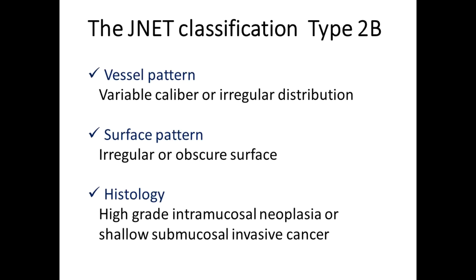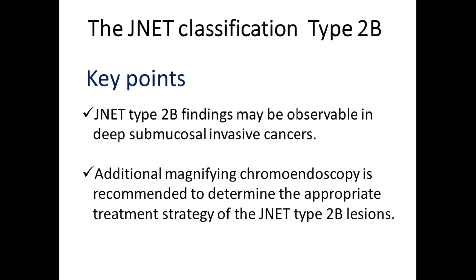The vessel feature of J-Net Type 2B is irregularity, which means that the calibre of the vessels is variable and their distribution is not regular. In contrast to Type 2A, the tubular structure on the surface becomes obscure or irregular. The most likely histology is high-grade intramucosal neoplasia or shallow submucosal invasive cancer. J-Net Type 2B findings may also be observable in deep submucosal invasive cancers. Additional magnifying chromoendoscopy is recommended to determine the appropriate treatment strategy for Type 2B lesions.